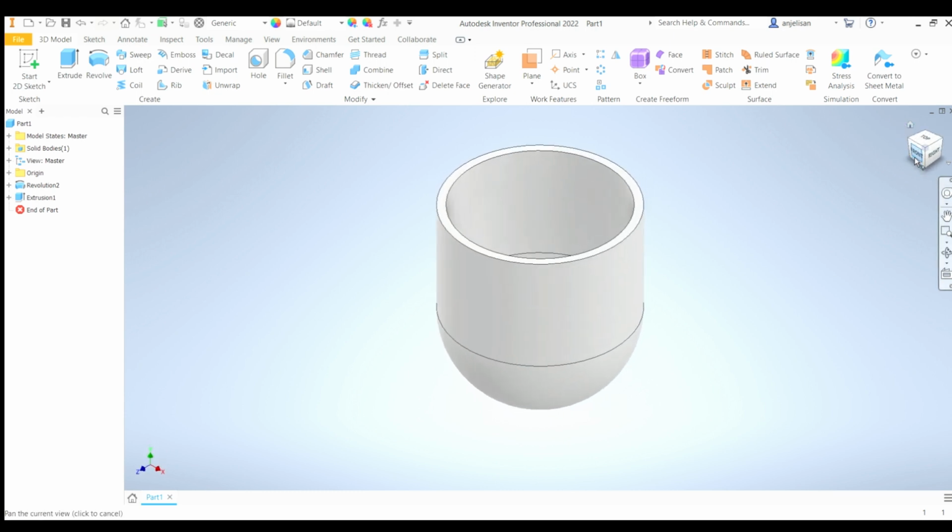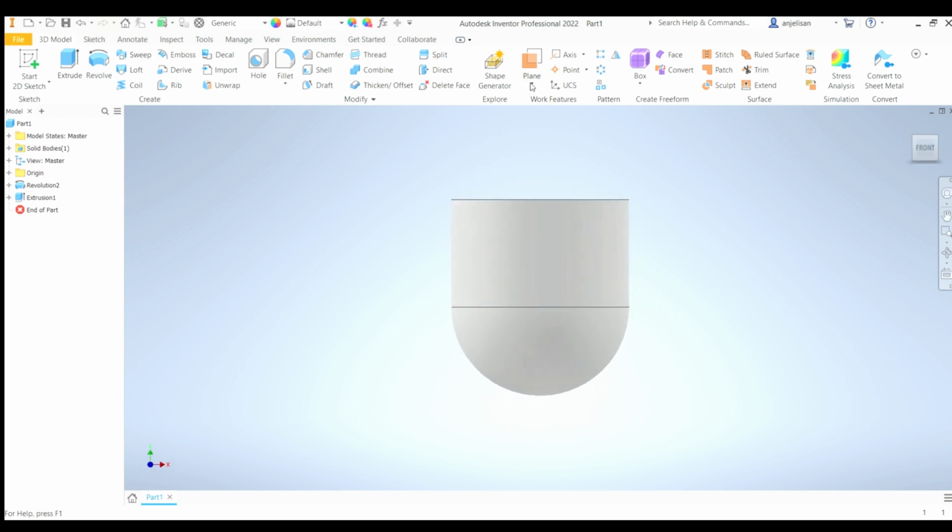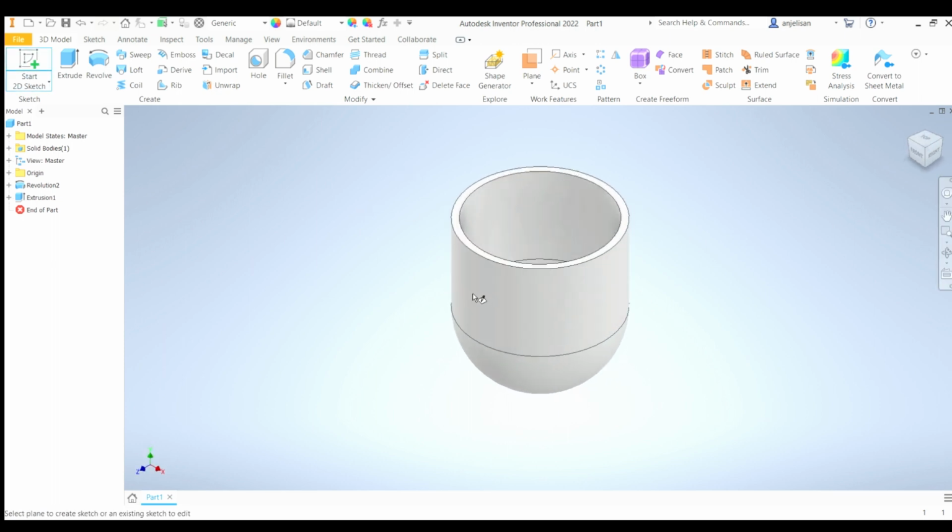Now it gets a little trickier, maybe for some of you, or maybe a lot of you. So we go down to the plane drop down menu and we hit tangent to surface and parallel to the plane. We can't simply use the 2D sketch tool to create a sketch along this cylinder. It's not flat.